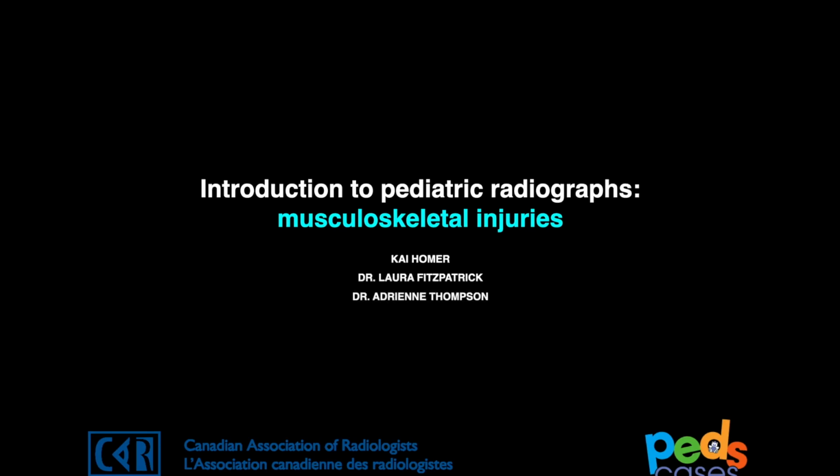Hi there, my name is Dr. Kai Homer and I'm a resident in radiology at the University of Alberta. This video is the second in a series discussing musculoskeletal radiology in children. We're going to focus on musculoskeletal injuries and go through some cases to help you understand how radiology fits into the whole clinical picture. In this video, we're going to go over wrist injuries.